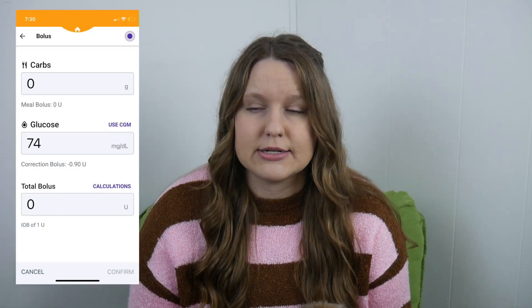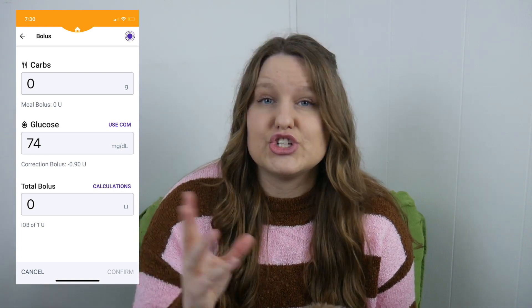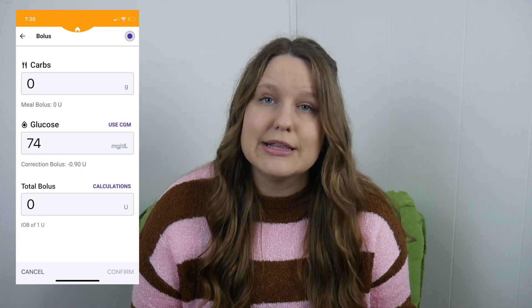The system is always trying to bring you back down or up to your target number. Those customized targets can have up to eight segments throughout your day, so you could have a different target for daytime versus nighttime. It adjusts insulin based on projected blood sugars 60 minutes into the future. In the bolus screen there's a 'Use CGM' button — if you click it, it brings in not only the CGM value for your bolus calculation but the trend arrow as well, so if you're going up it gives more insulin, if going down it gives less. This works even in manual mode.